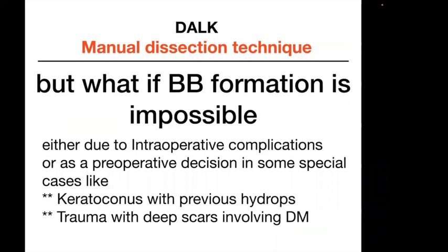But what if big bubble is impossible, either due to intraoperative complications or as a preoperative decision in some special cases like keratoconus with previous hydrops, or trauma with deep scar? What would be the solution? The solution is manual dissection or layer by layer dissection.